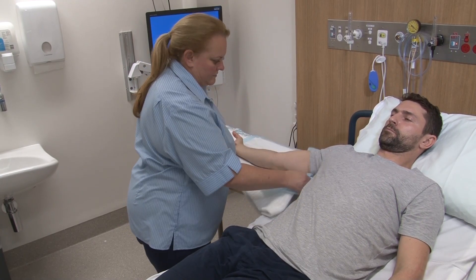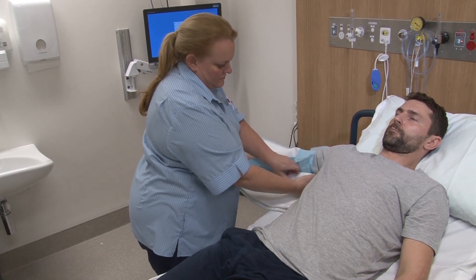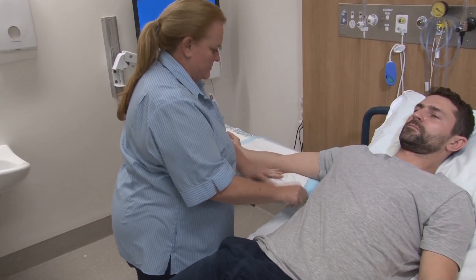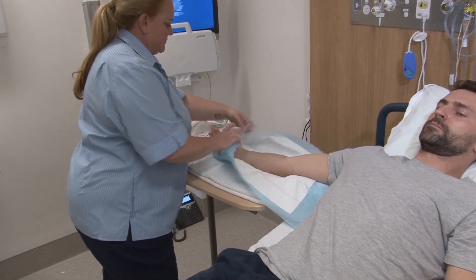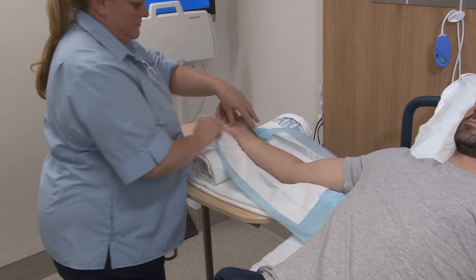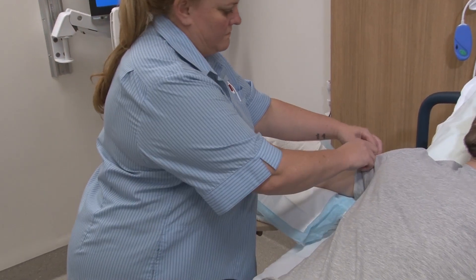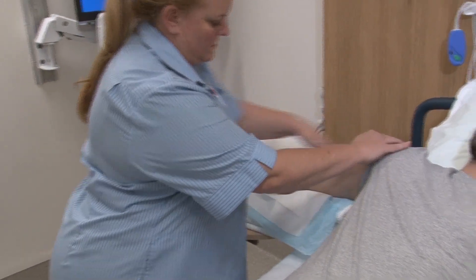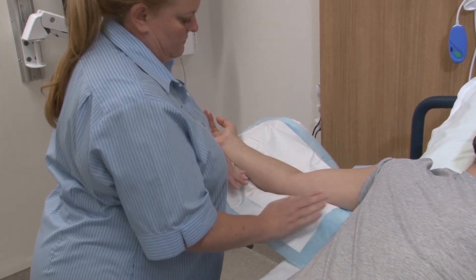Check the patient's ID, explain the procedure, and answer any outstanding questions the patient may have. Where possible, position the patient with slight elevation of the bed head, with the arm perpendicular to the body and supported comfortably. Typically the right arm is used, but either can be used based on vein suitability.